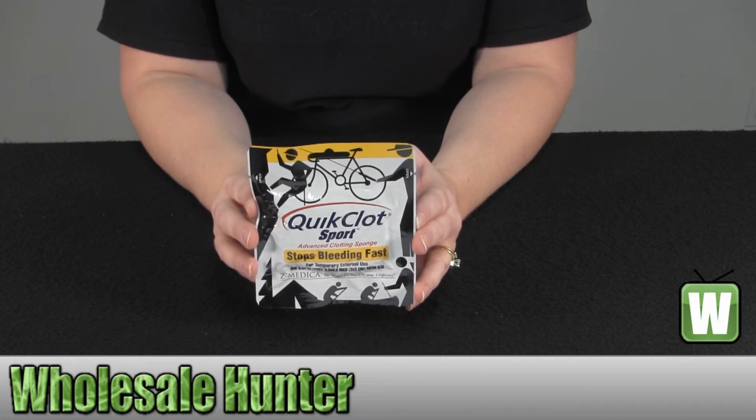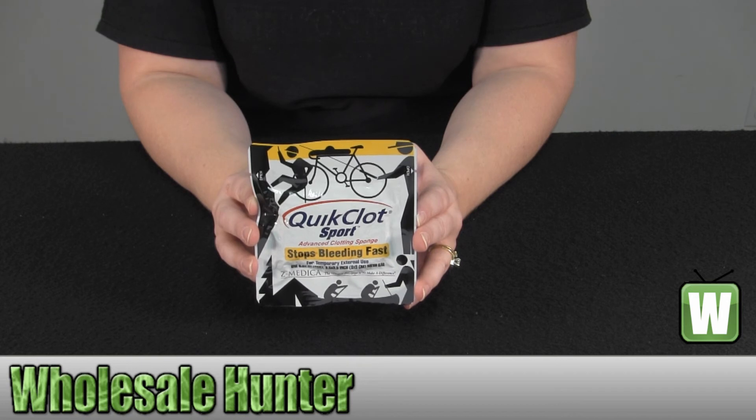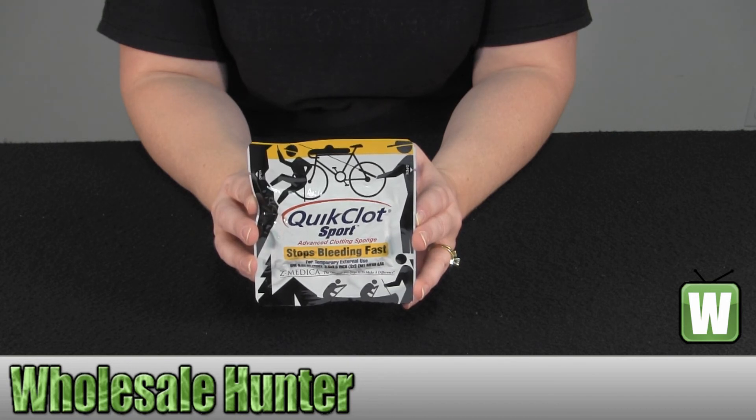Again, this has been the unboxing video for the Quick Clot Sport 25 gram made by Adventure Medical, manufacturer number 5020-0001.